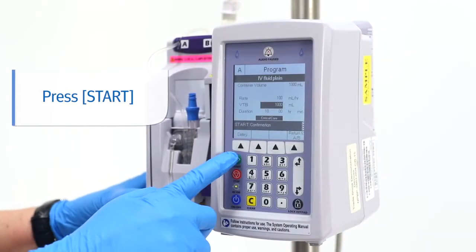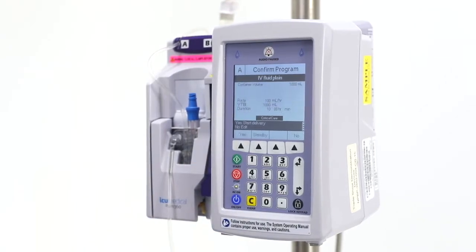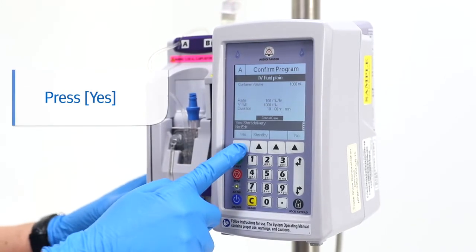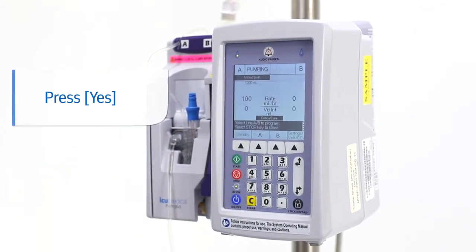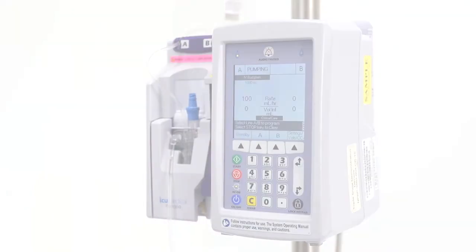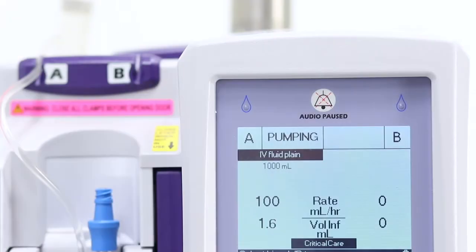Next, press start, review the program, and confirm by pressing yes. The infusion will start and the status of line A shows pumping while the flow indicator is flashing green.